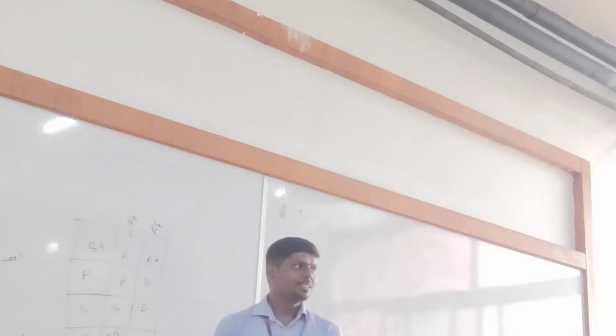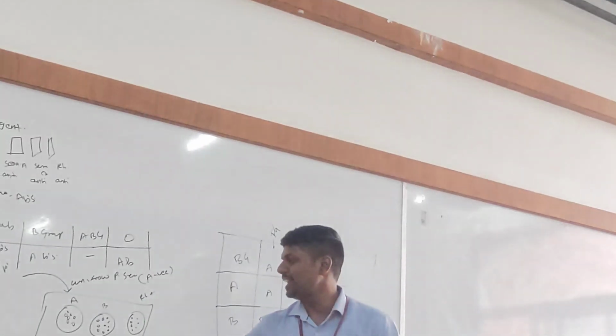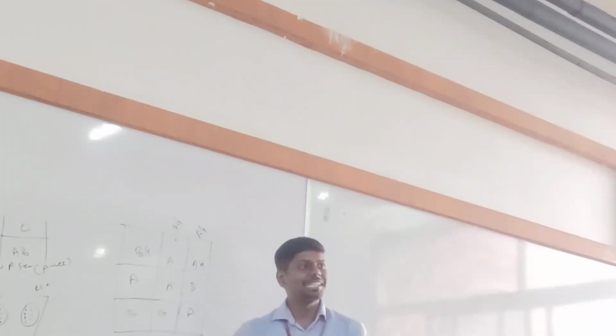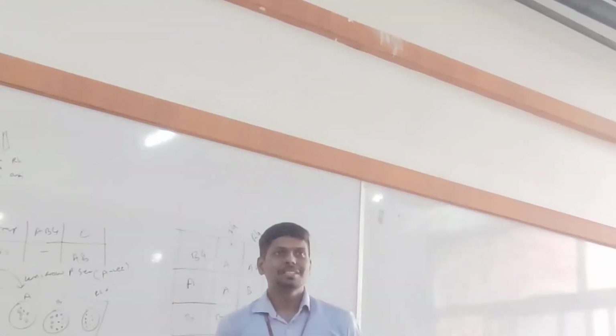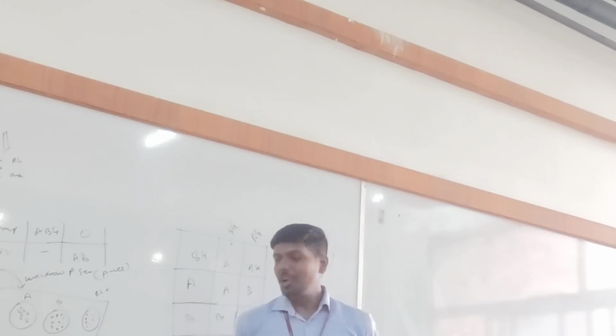Got it? Now listen. Now tell me, in reverse grouping, I got a reaction here and here. What is the blood group now? Wrong. This is reverse grouping, keep in mind. In reverse grouping, what is this group? O negative.